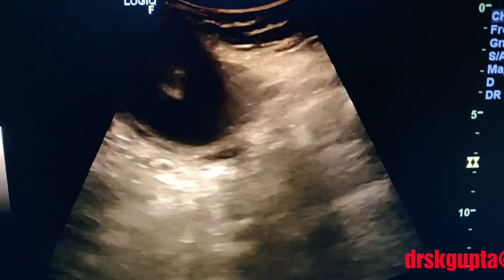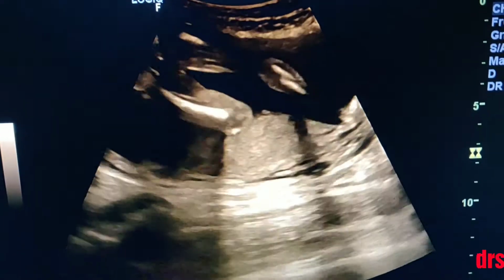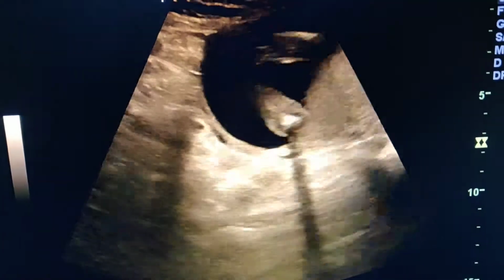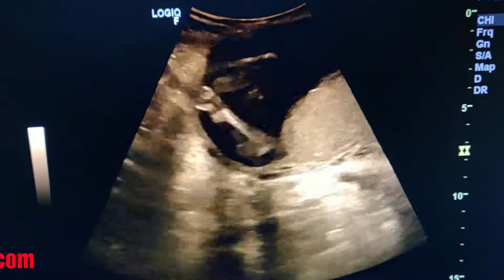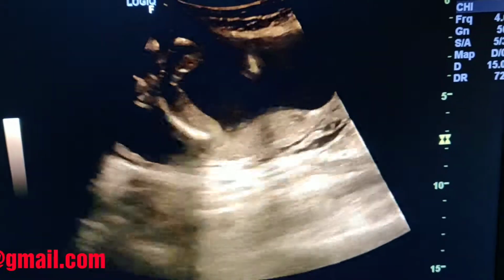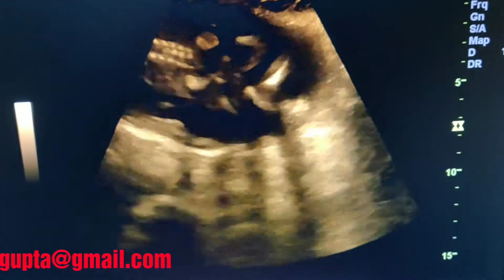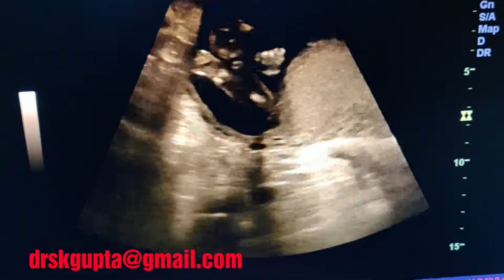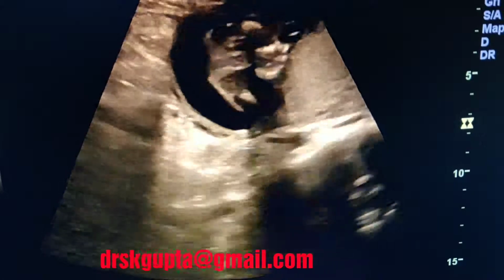The anomalies inside the heart may not be visible immediately at the birth, but the gross and congenital anomalies like cleft lip and the limb anomalies are immediately visible. So all effort should be made to rule out the club foot. All 4 limbs should be seen, and try to spend some time in tracing the limbs, tracing the spine, and looking at the upper lip to rule out the cleft lip. You see both the feet so beautifully, and there's no club foot in either of the feet.